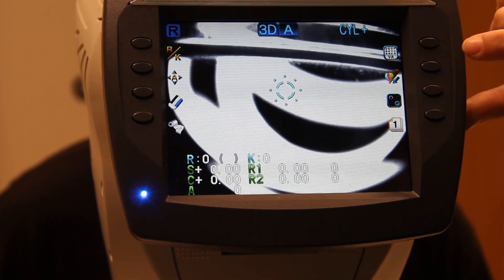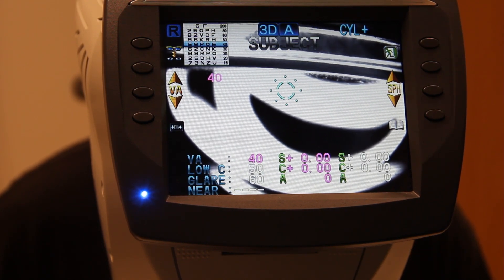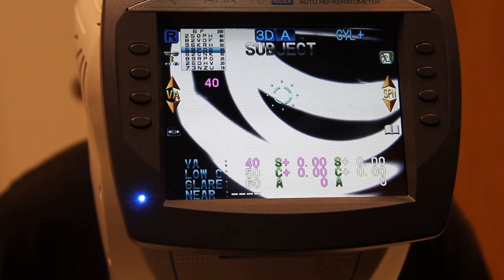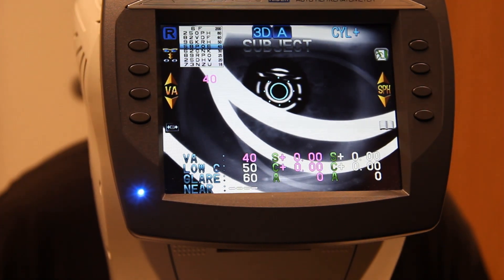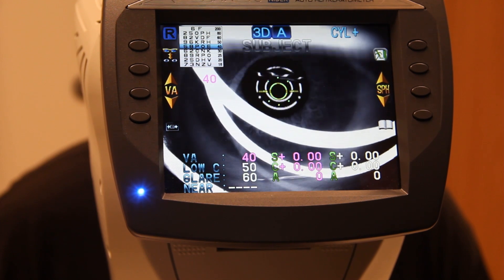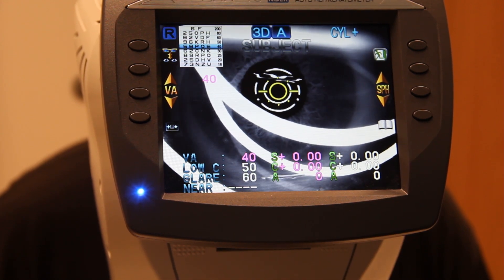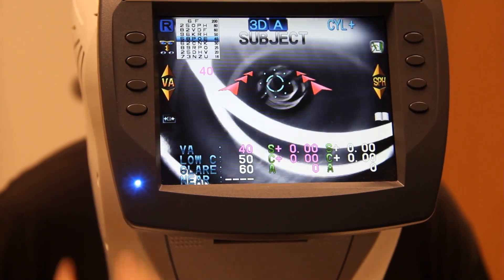Our veteran has his glasses on and is all positioned. First, bring up the Snellen chart by hitting this button on the top right — the little running man should appear. Now come forward slowly, get aligned with their pupil. If you go too far it'll turn blue again; you want to get it right in the center where it's nice and yellow.